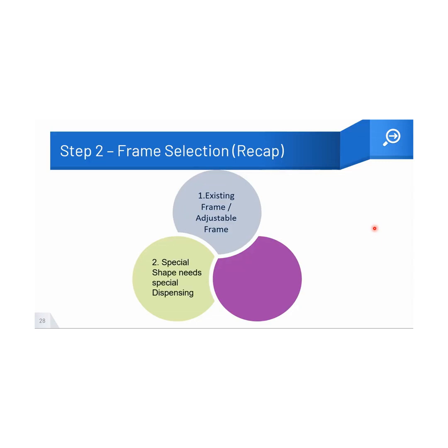If I have to point out, what we spoke about is to select a corridor according to the frame size. Please ensure that you are aware of PDs. Make sure for a smaller PD, you go with a smaller A size, and for a larger PD, anything beyond 32, you are in a comfortable position to dispense any special frames as well. And then always give an honest opinion to your customer.